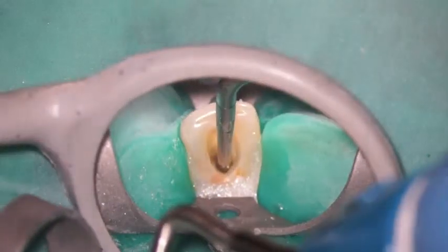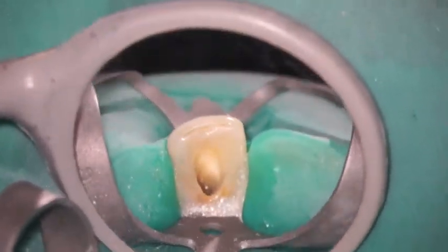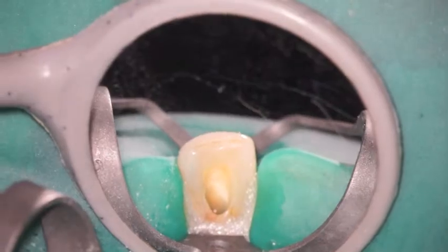So in essence, the larger the size of the apical foramen, the further that we want to be from that, and we want to cut off the cone more.